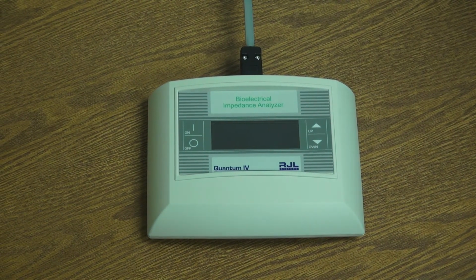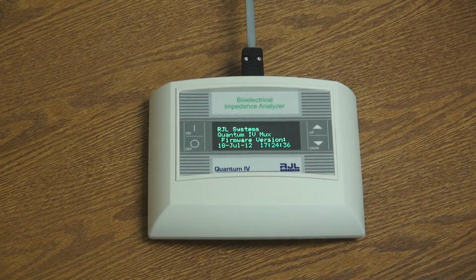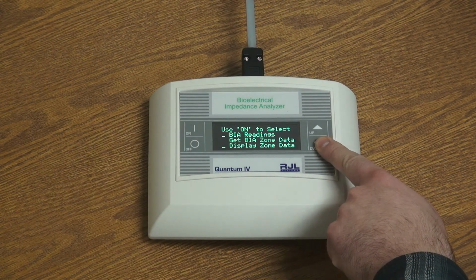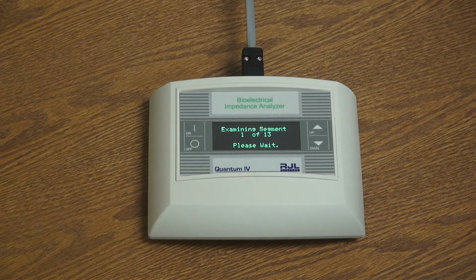Ensure that the cable is securely connected to the Q4 and turn it on. When it gets past the splash screen, it will show you the measurements for one of the zones. Press the On button to get to the main menu. Press the down arrow once so the blinking cursor is next to Get BIA Zone Data, and hit the On button again to run the test. It will take a couple of minutes to run through all 13 zones, so I'm going to speed this video a bit until it is done.